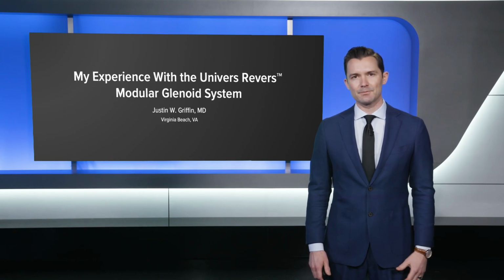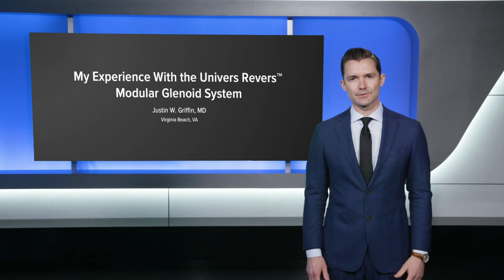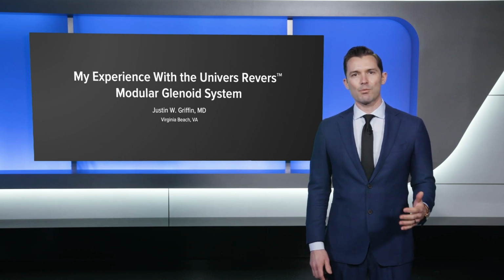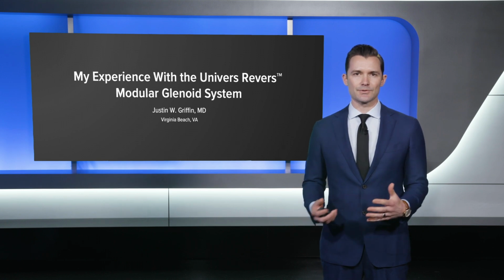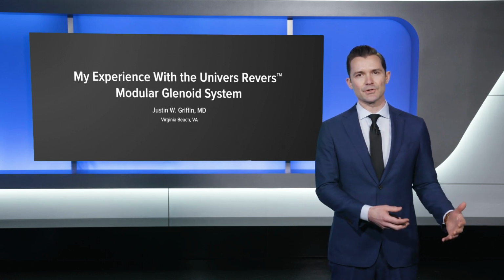Patients with small anatomy present unique challenges in shoulder surgery. I feel it's really important to choose an implant system that adapts to your patients as opposed to trying to choose patients that will adapt to your chosen system.